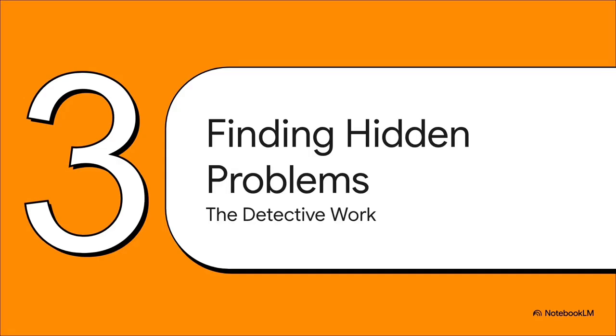But a broken or knocked out tooth is often something you can see pretty clearly. The real magic, the real power of X-rays is finding the problems you can't see, the hidden issues lurking just beneath the surface. This is where the real detective work begins.